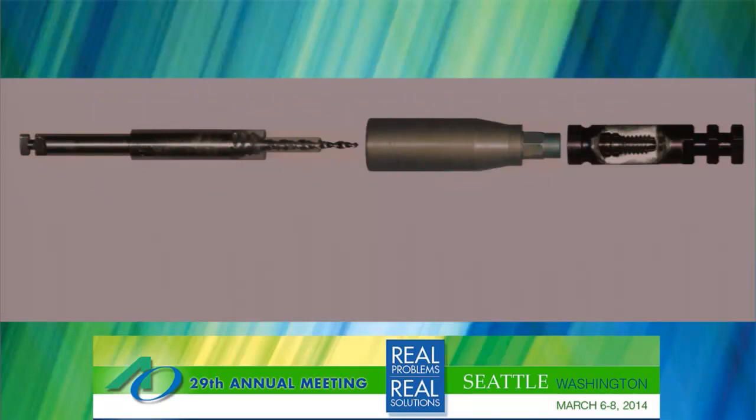This happens to be an implant. It was a case that I looked at the manufacturers, what they had for this particular implant. They had a guide, they had a recovery tool, and they had a handle for it, and they charged about $500 for it. And so I looked at it. The rep dropped one off for me to take a look at it.